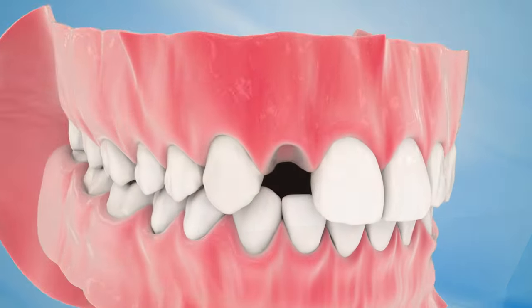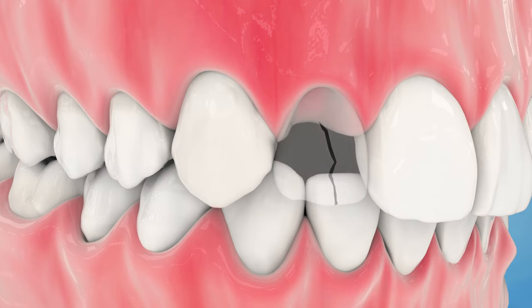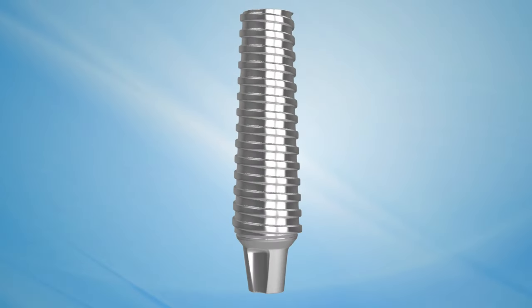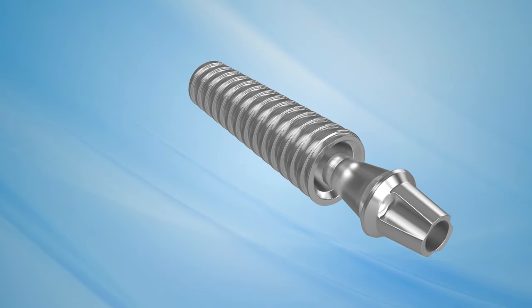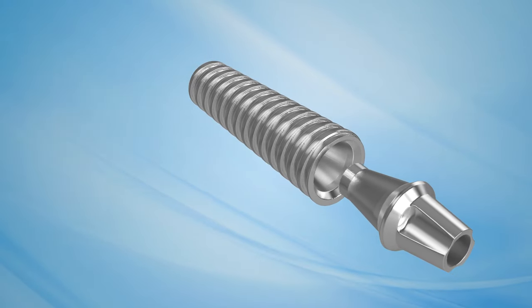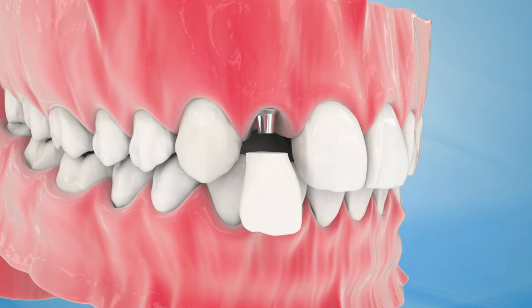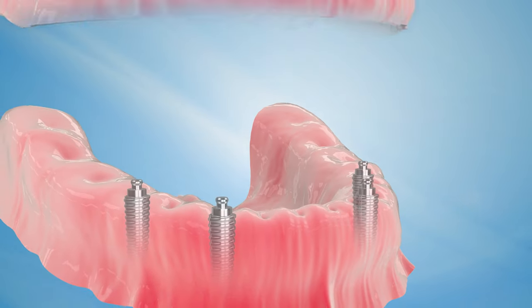For teeth that are missing or damaged from disease, decay, or fractures, a dental implant is an excellent long-term solution to restore a smile. A dental implant is a cylindrical post, usually made of titanium, that serves as a substitute for a lost tooth root. Dental implants can replace individual teeth, several teeth, and even uncomfortable dentures.